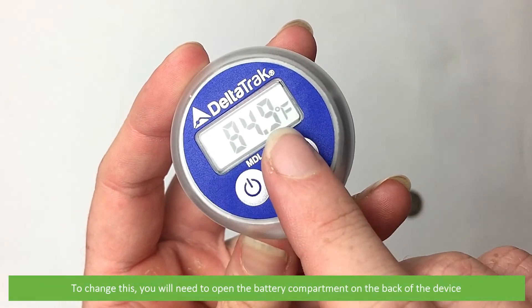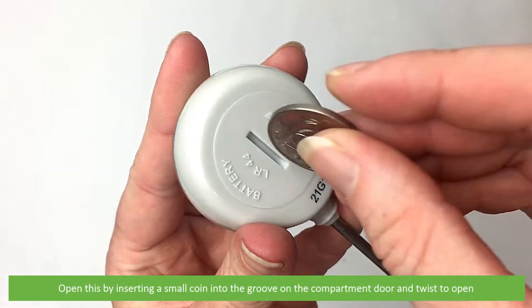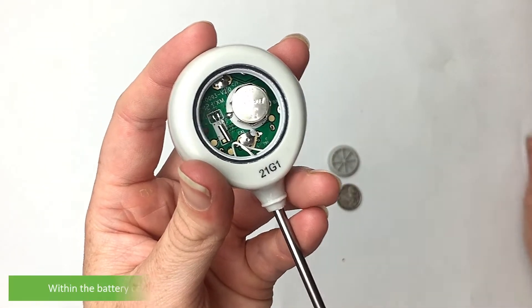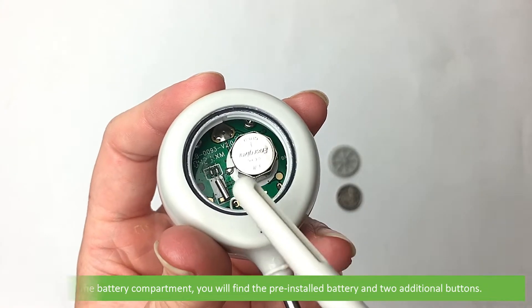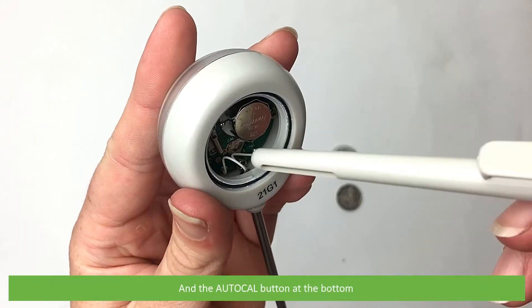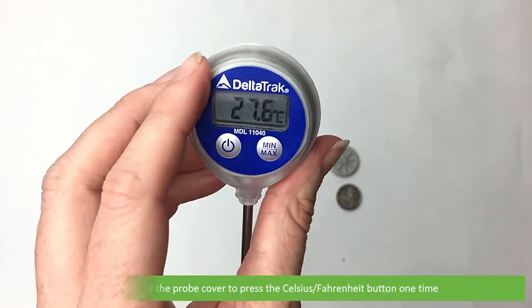To change this, you will need to open the battery compartment on the back of the device. Open this by inserting a small coin into the groove on the compartment door, then twist to open. Within the battery compartment you will find the pre-installed battery and two additional buttons — the Celsius/Fahrenheit button on the top and the AutoCal button at the bottom. Use the tip of the probe cover to press the Celsius/Fahrenheit button one time.